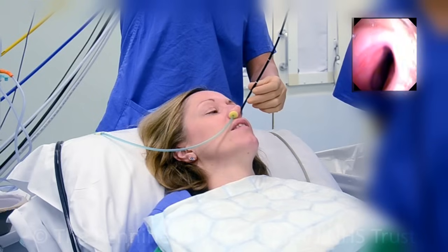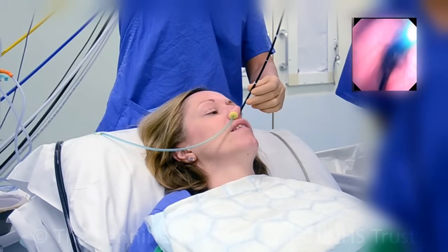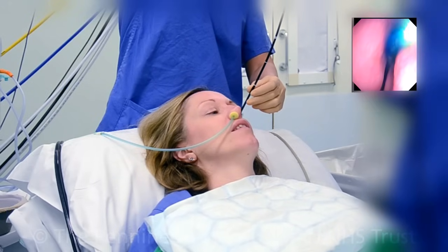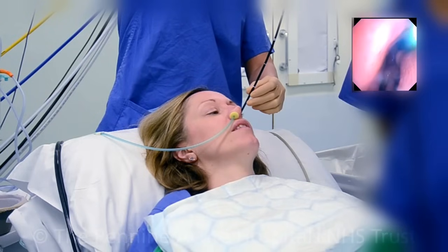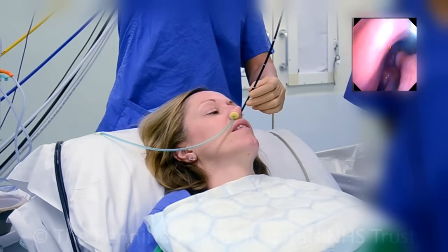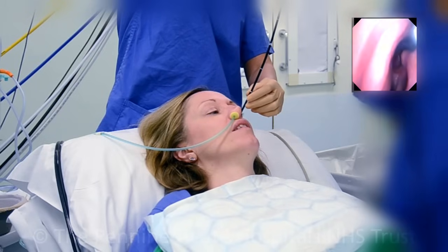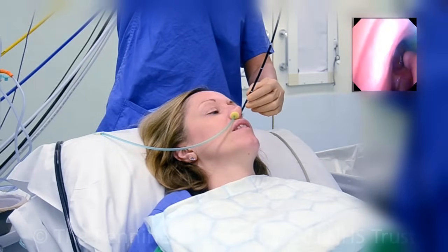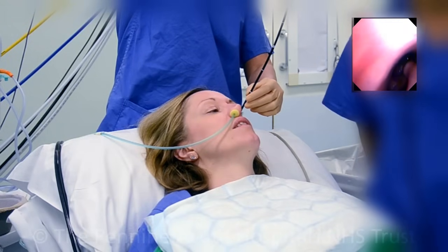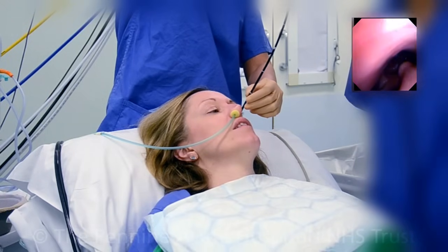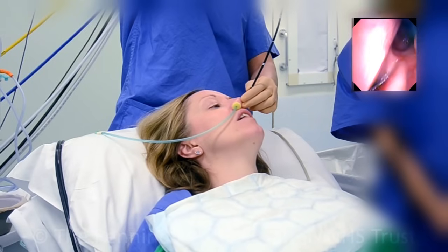Now that your nose and mouth are completely numb, a fine camera is inserted into the preselected nostril. It is small and thin enough to go through your nose and into your windpipe without discomfort. The passage of the camera through your airway to the windpipe can be viewed on a television screen.